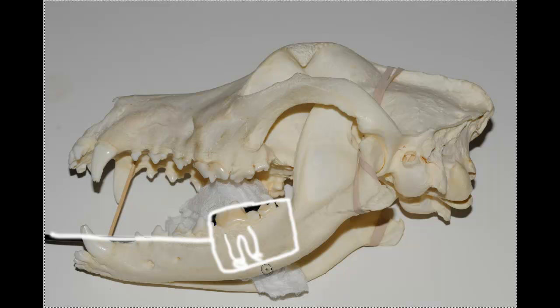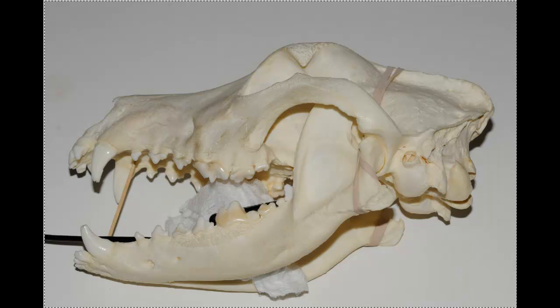On a live animal, you have an elastic tissue down in the bottom of the mandible or jaw that wants to make that sensor rise upward and away from getting the apexes. So the trick here is to wedge something that is firm enough to hold the sensor down but not so hard as to hurt the animal. So basically we want to wedge something in here in order to hold that sensor down.